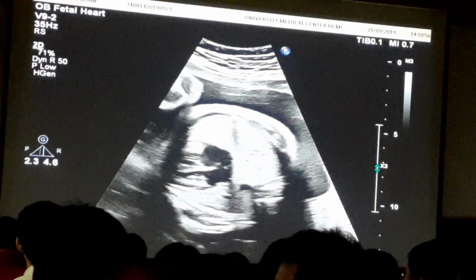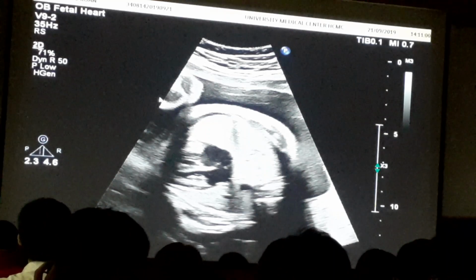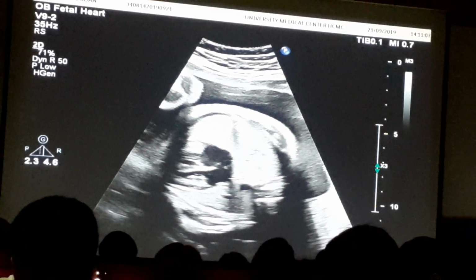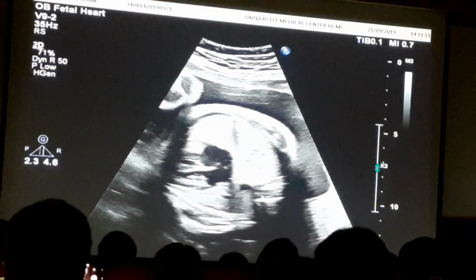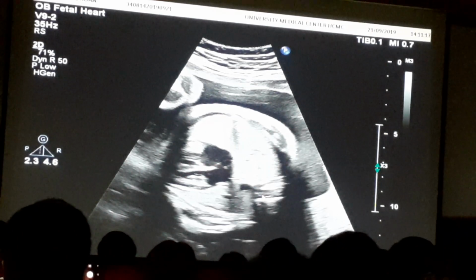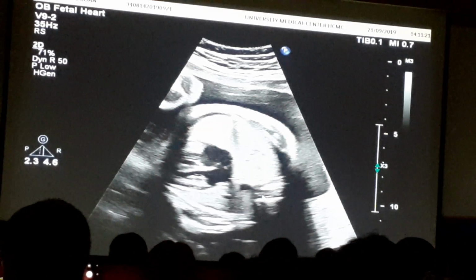So here's a nice four chamber with a single rib on each side. It's nice and round. We see the spine here. The heart is here, occupying about a third of the chest. Mình thấy là mình quét ngang qua đúng một cái xương sườn, cái này cũng một xương sườn, cho nên là cái mặt cắt này là đúng. Cái cột sống đây, cái xương ở đây.